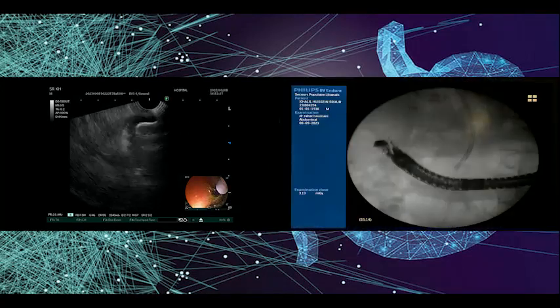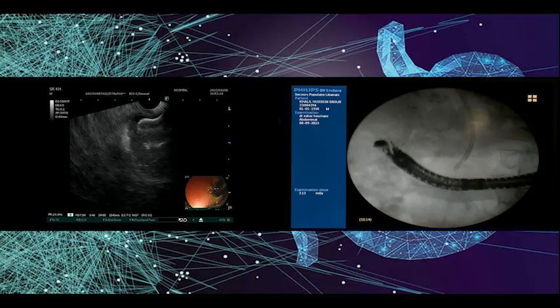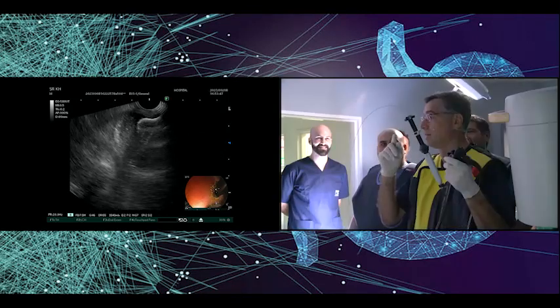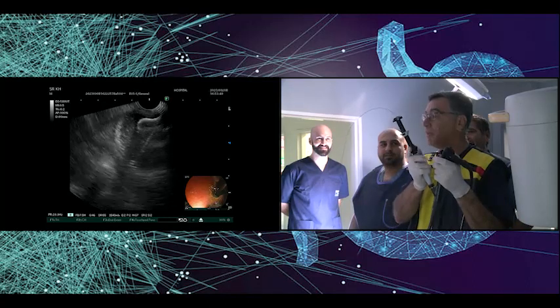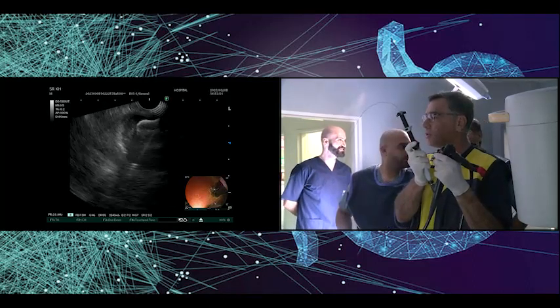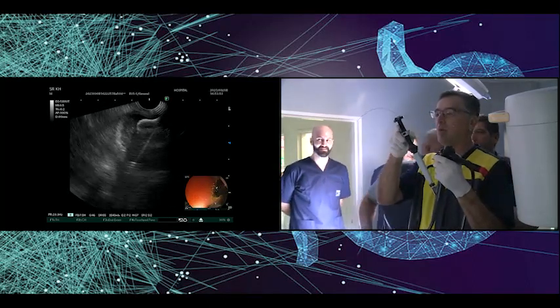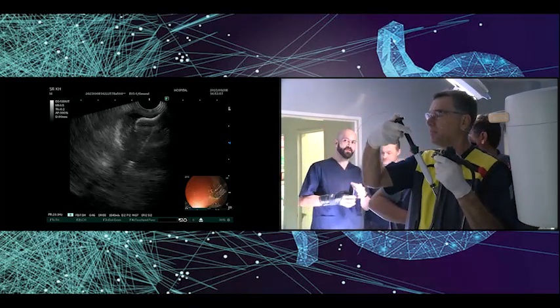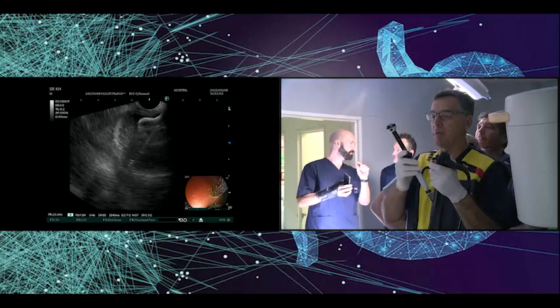Okay. So you also prefer to do it endoscopic? Yeah, yeah. In this case, yes. Because we started with Geoffroy in the school of X Lumina before having the hot Axios, okay? So now I will go very fast, okay? And I will release, okay?